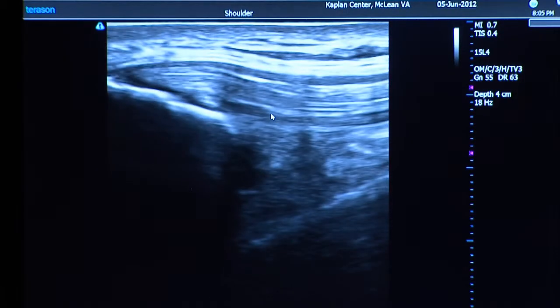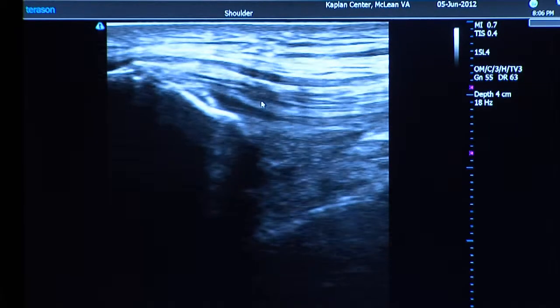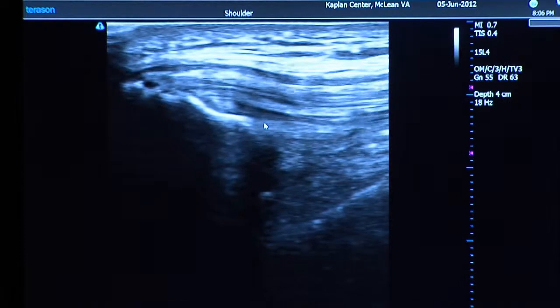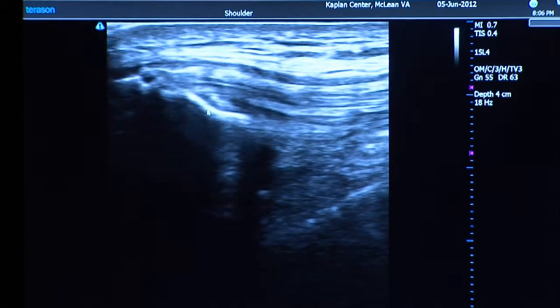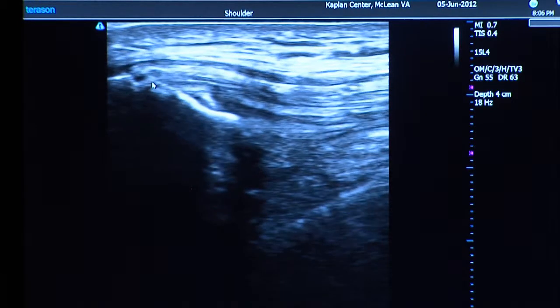If I freeze it here you can see that bright parallel pattern — same thing we showed with the Achilles tendon. The quadriceps tendon has a similar appearance and looks pretty good; we're not seeing any darkening or thickening. There's a tiny little bone spur right there, less than one millimeter.